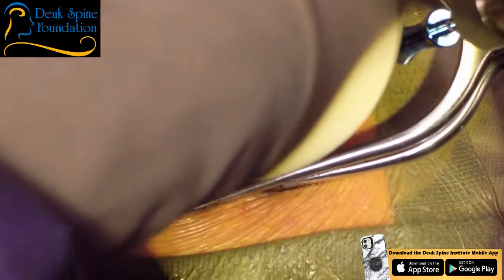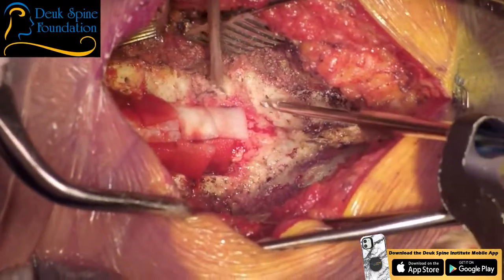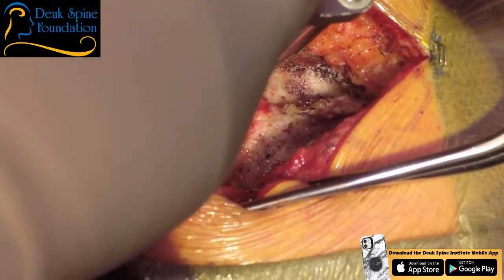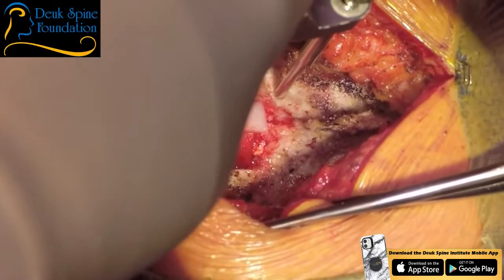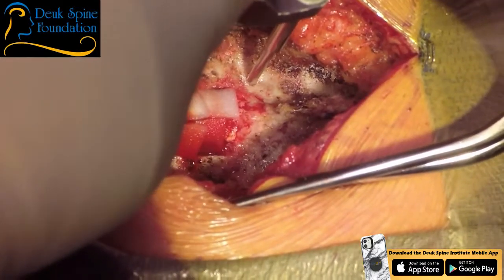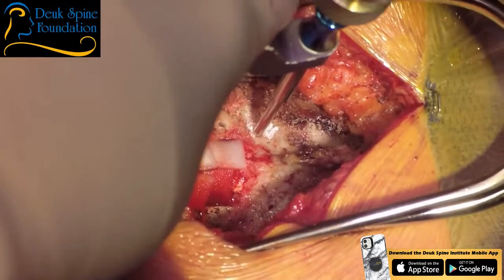Same thing, up and out, 20 degrees. Now here comes T1 and T2, okay? T1 and T2 are pedicle screws. They're not lateral mass screws. And you want to make sure you don't hit the spinal cord, but your trajectory is different. Again, I let it crawl down the pedicle.